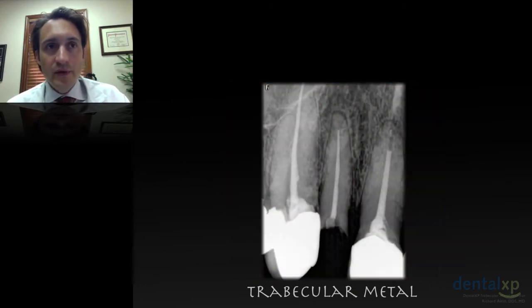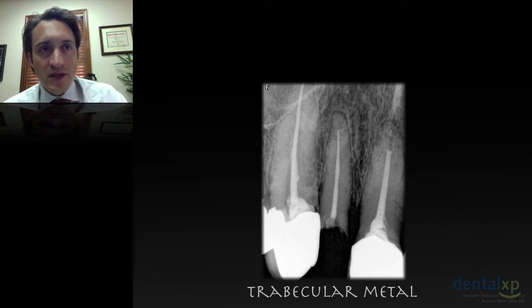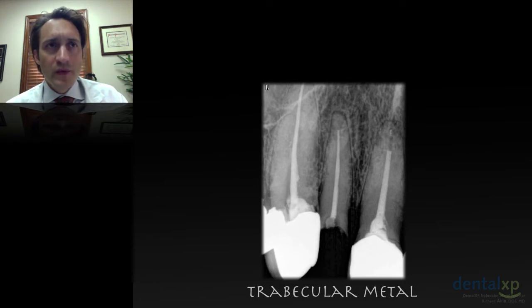Here's the periapical image. Just notice the interproximal bone. I'm always taking note of that to determine if we expect our papilla to come back. Of course, this patient doesn't have a great interproximal peak, but very thick tissue, so we could expect to get good papilla fill. And most importantly, from a provisionalization standpoint, I like to have good apical bone volume. You can see we have great apical bone at this site, no true periapical lesion.